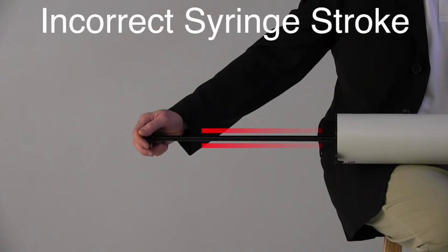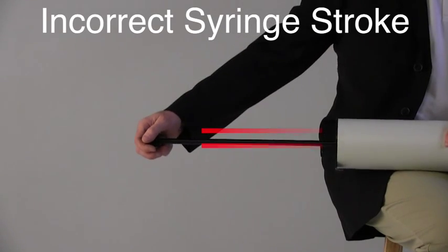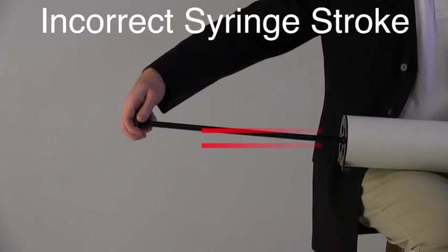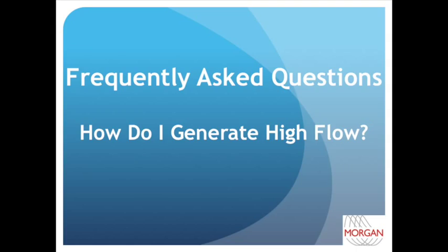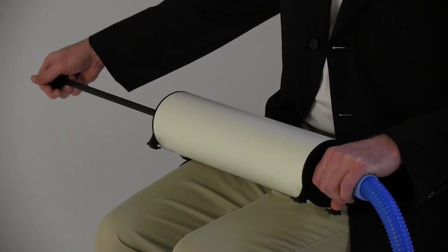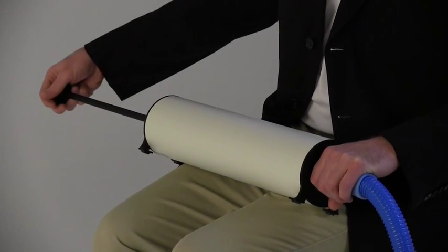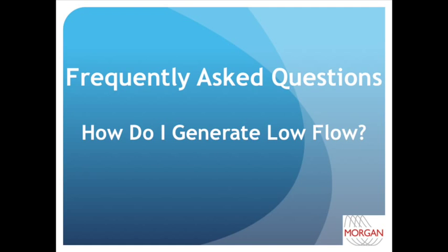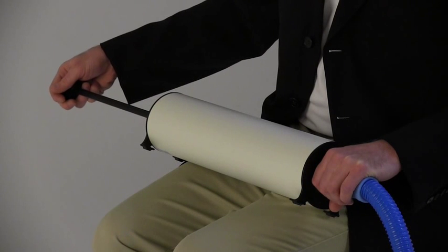Now here are some incorrect syringe stroke positions. You want to keep the piston rod straight — do not torque it up or down, because this could impact the accuracy of the volume being produced by the syringe. To produce high flow rates, it's best to start fast and then slow down as you get towards the end of the stroke. To produce low flow rates, it's best to have a consistent slow motion and not start and stop in a jerky motion.